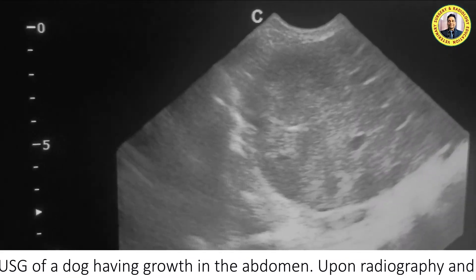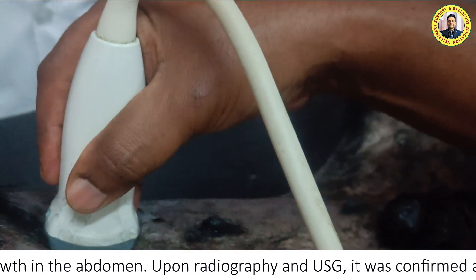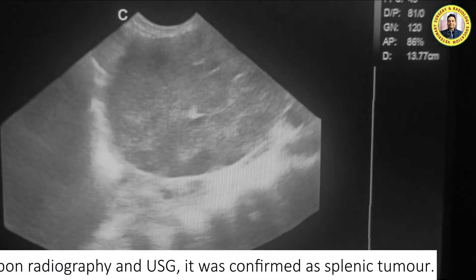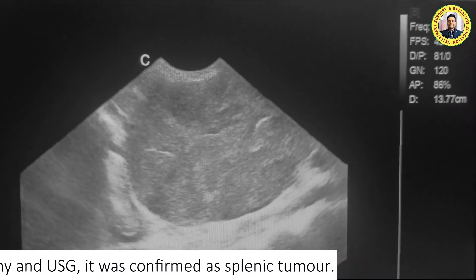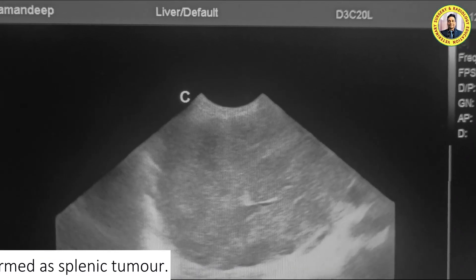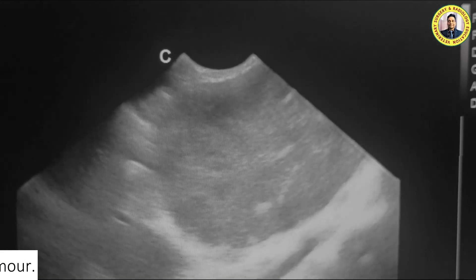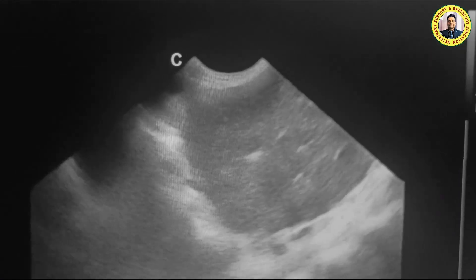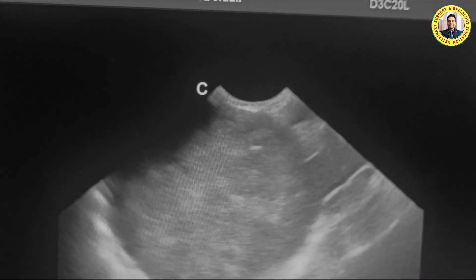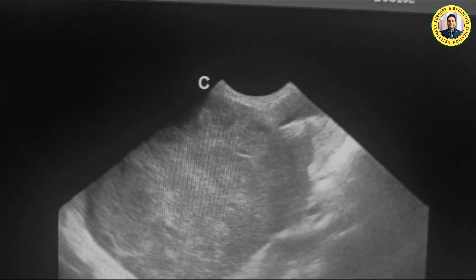Now see the position of the transducer — it is towards the left side and is immediately over the hard mass. You can see the echogenic soft tissue echogenicity here. Our intention is to determine which structure this is and from where it is originating, because this hard mass was quite clear upon physical examination.